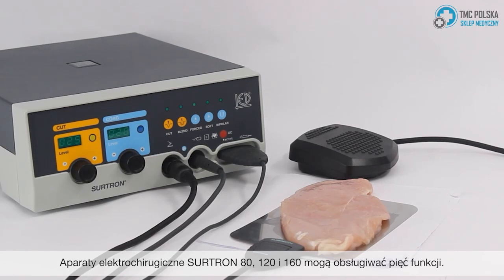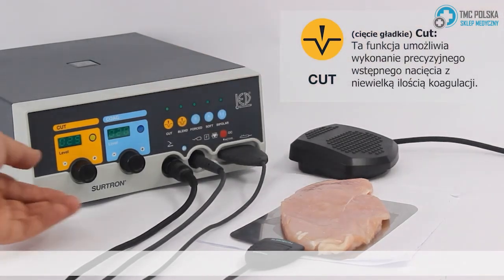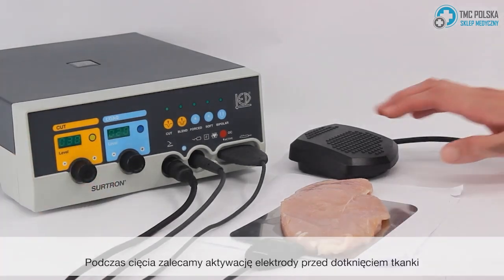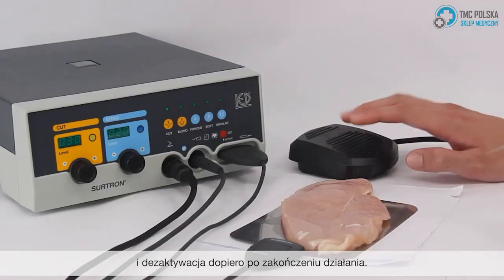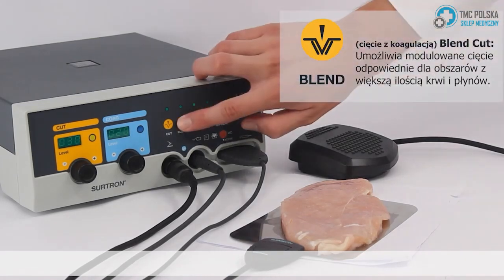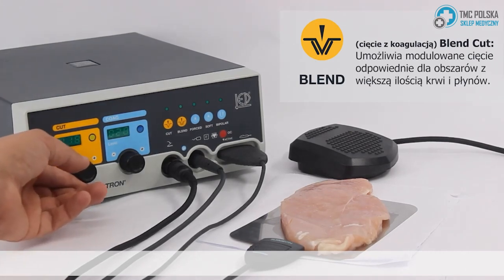The Surtron 80, 120, and 160 can run five functions. Pure cut: this function allows you to make precise initial incisions with a light amount of coagulation. When cutting, we recommend activating the electrode before touching the tissue and deactivating only after you have finished operating. Blend cut: this function is modulated and provides a bit more coagulation, suitable for areas with more blood and fluids.